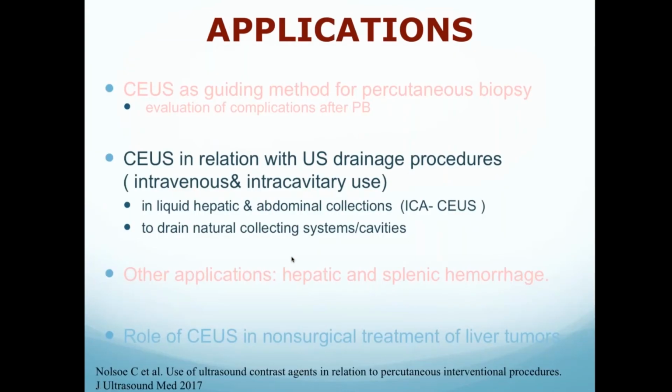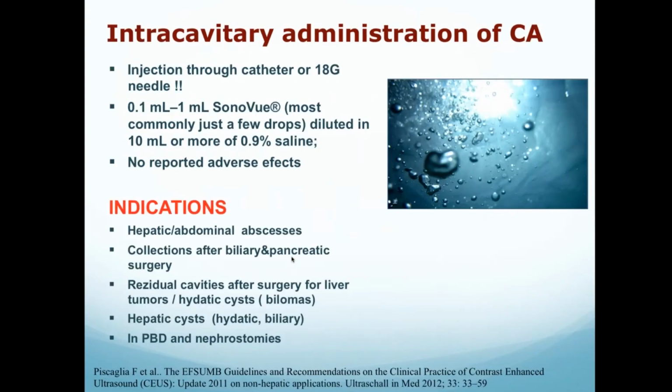What about the drainage procedures? We can use it both intravenously and also intracavitary. For intracavitary use, we mix 0.1 ml or even more with 10 ml or more of saline, and we can inject this through a tube or a needle.